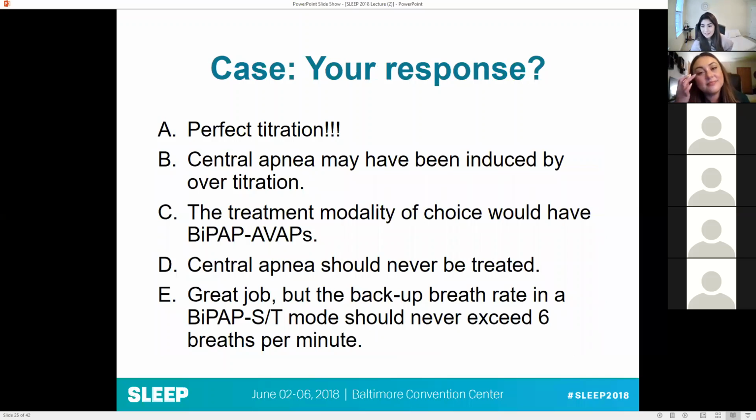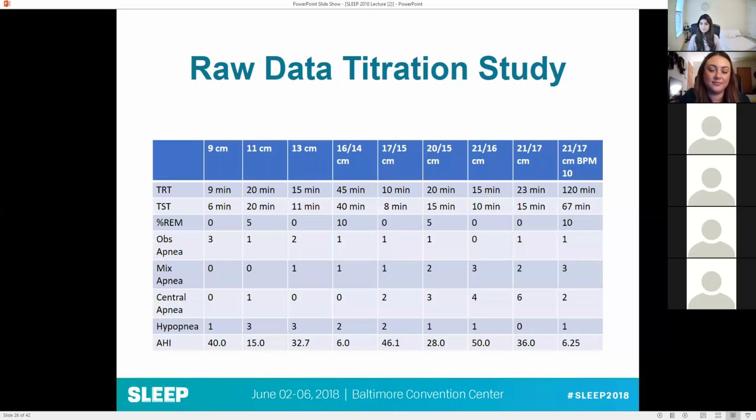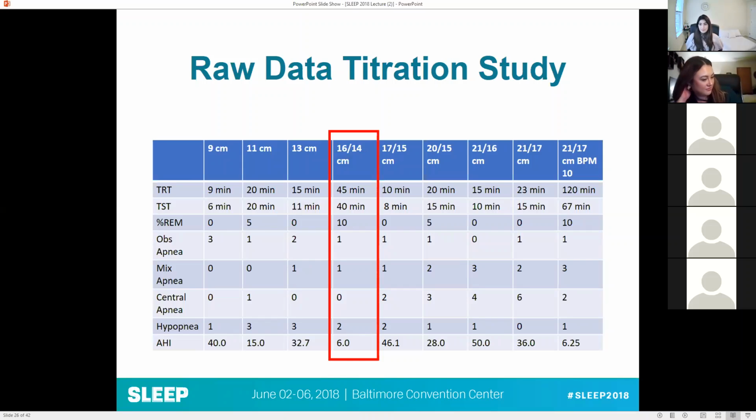Oh, yeah, here we go. Sorry. It's been a while since I gave this talk. Go ahead and go to the next slide. I think I hit it again. Yeah. So you guys can see here, I would call that a win, right? Look at that. 45 minutes, slept for 40 minutes, had a good amount of REM sleep, and the AHI went from 53 to 6. I would definitely call that a win.